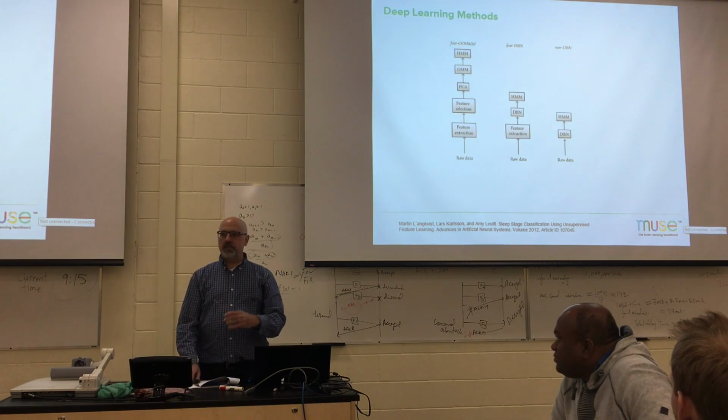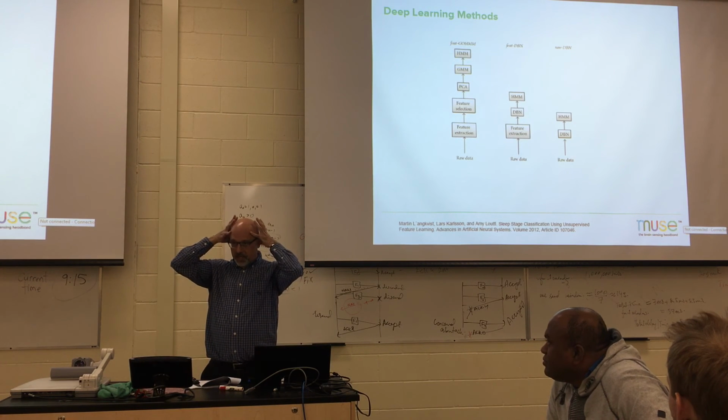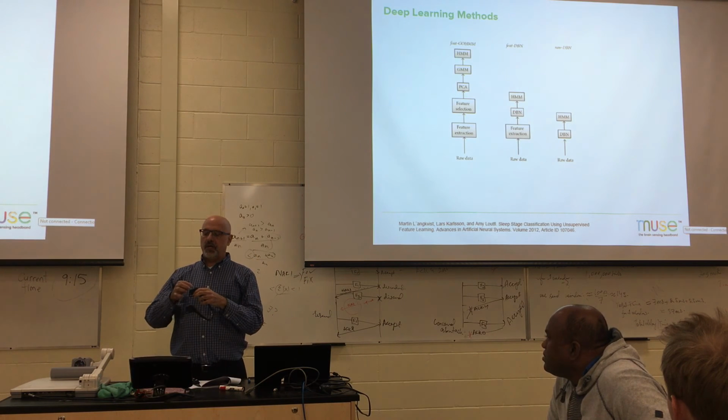No. It's meant to look at the forehead and hook over the ears. That's the way it was designed. That's the way it'll fit snugly and securely. The electrodes here are not designed to go through hair. Okay. Right. There is an auxiliary electrode.